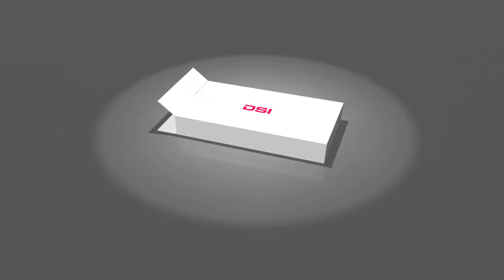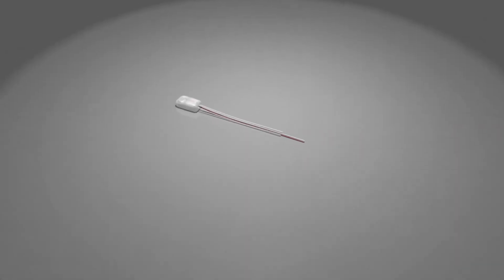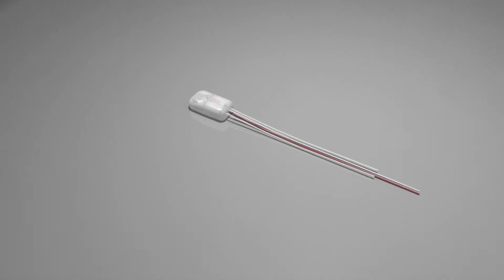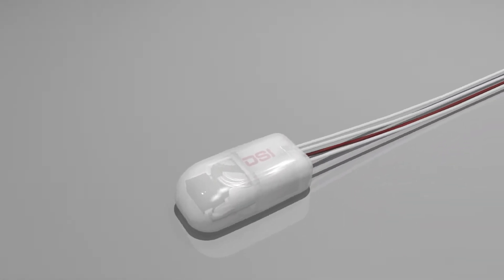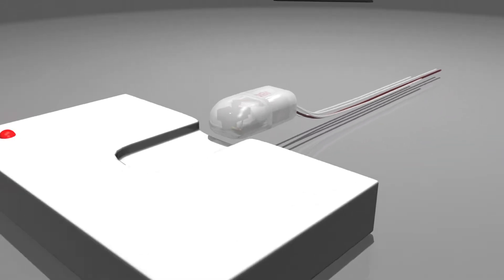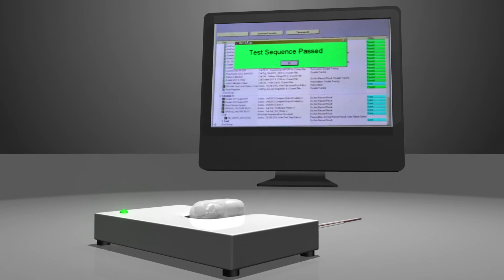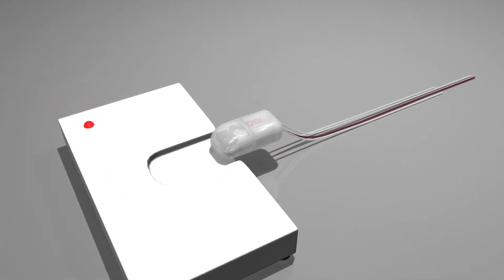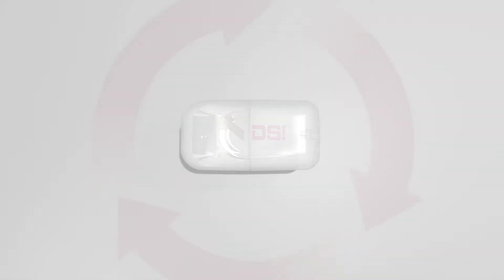DSI receives implant exchanges in our returns department. They are inspected, decontaminated and disassembled. At this point, they are ready to merge into manufacturing with other exchanges and first-time build implants.